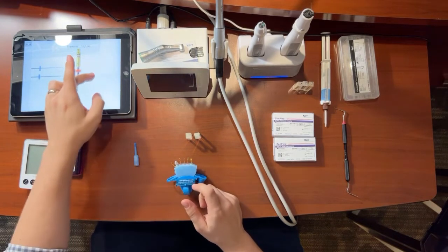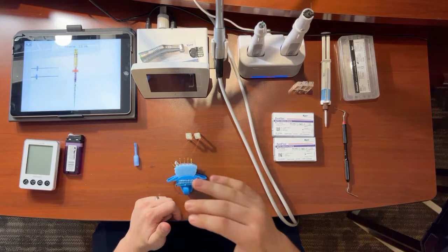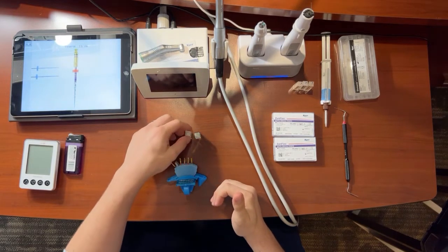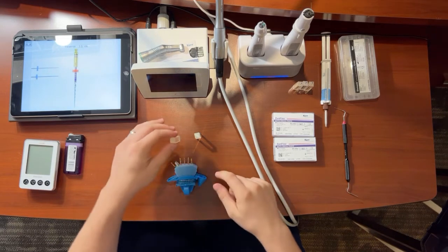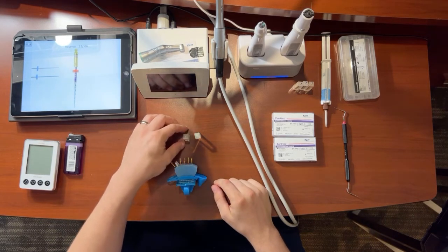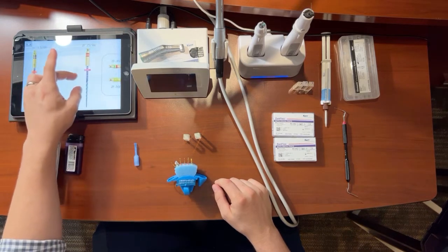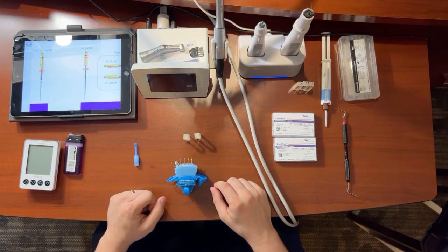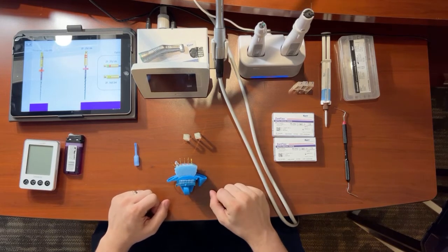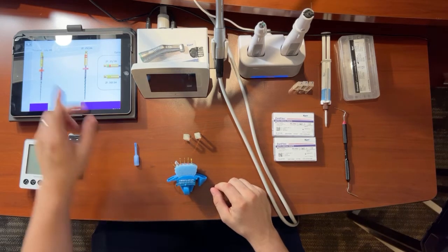After you've created that glide path, which is essentially creating a small tunnel or a pilot hole all the way down to the terminus, then you're going to go into your shaping file. And trust me when I say creating a glide path is going to give you a much smoother experience over other competitors' protocols that just require one endo file.